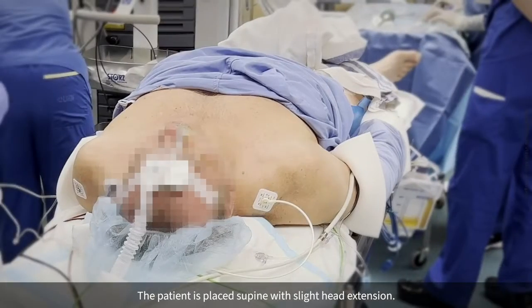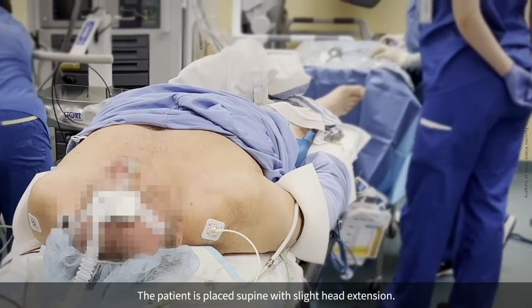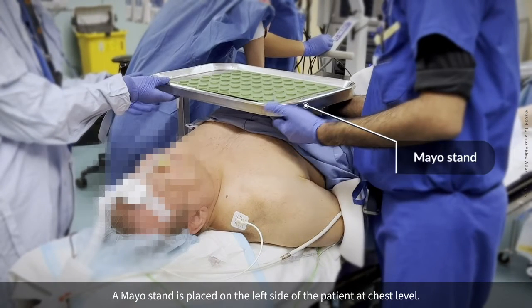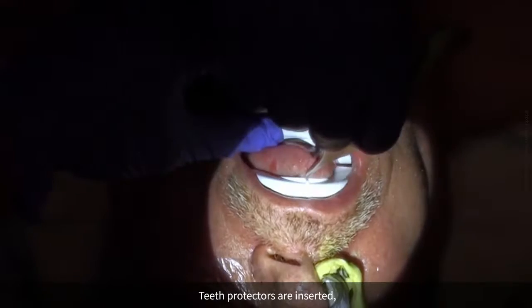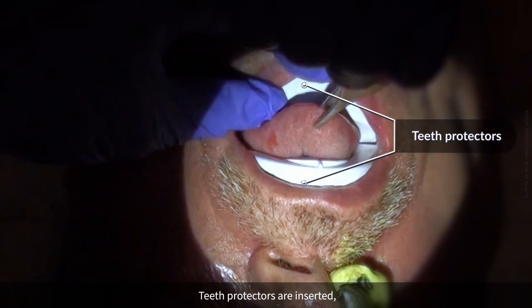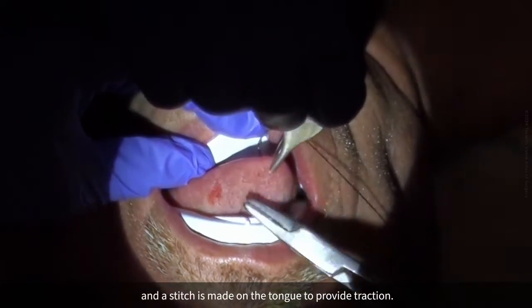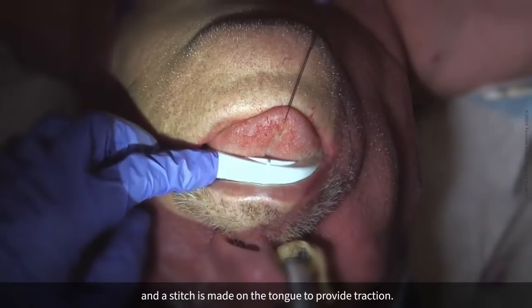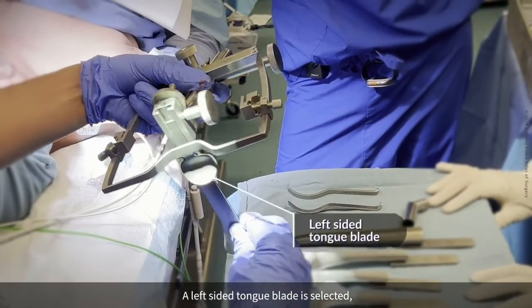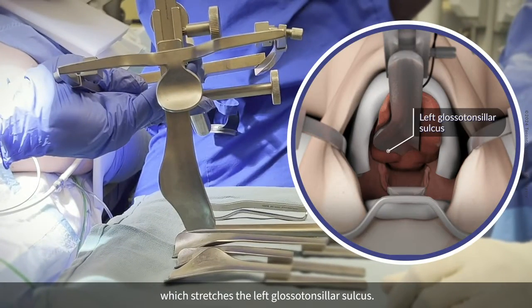The patient is placed supine with slight head extension. A Mayo stand is placed on the left side of the patient at chest level. Teeth protectors are inserted and a stitch is made on the tongue to provide traction. A left-sided tongue blade is selected, which stretches the left glossotonsillar sulcus.